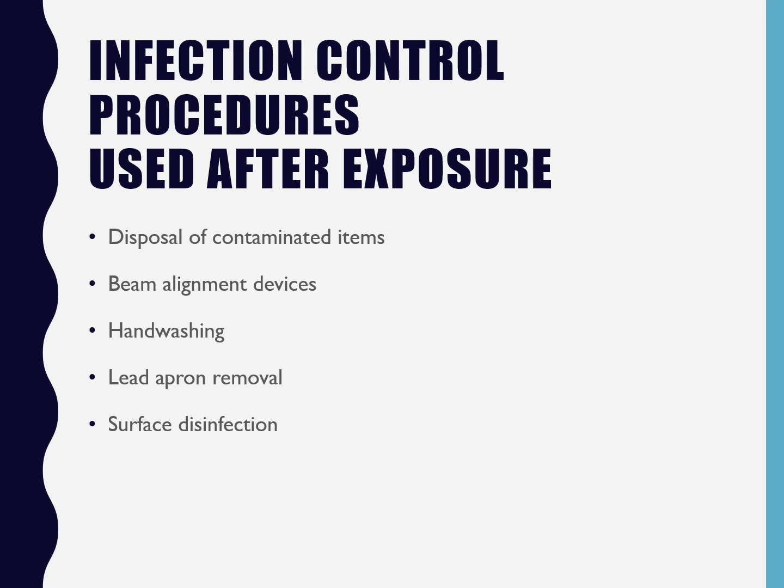If there are barriers left on, right, because there were barriers left on while you were walking your patient back to their room, they know if someone were to walk in and there are barriers everywhere, they know it's contaminated.